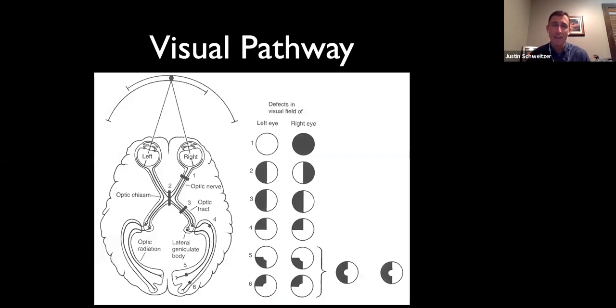And so what I mean by that is if you see a visual field defect that's only in one eye, like this one, number 1, that means it's in front of the optic chiasm. So it's affecting just the optic nerve head of the right eye in this particular example. Or if it was blacked out on this, it would be affecting just the left eye. So number 1 is an example of this could be glaucoma, okay? Or it could be something on the optic nerve head, all right? But I'm much more confident when it looks like this that it's glaucoma.